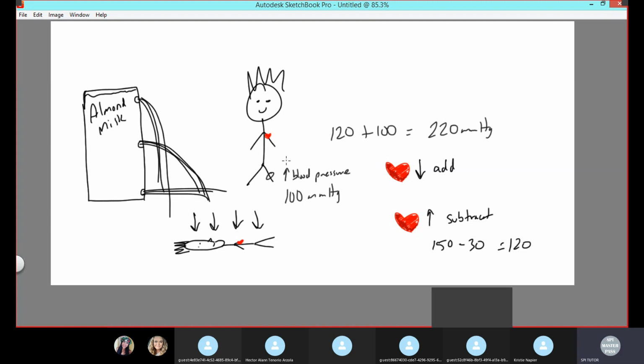Okay. So the best place to take it is at heart level, because it's supposed to be pretty much as accurate as possible at heart level. So if you're standing, they can take the blood pressure standing. They just have to make sure they take it at heart level. So you always notice that whenever they take your blood pressure, it's always at your biceps, because your biceps is heart level. Okay, so you're sitting down, doesn't matter. They put the cuff around your bicep. That's heart level. That's right next to your heart. Okay, so that's the reason why, because it offers a very accurate reading without anything adding or subtracting to it. So that's hydrostatic pressure.